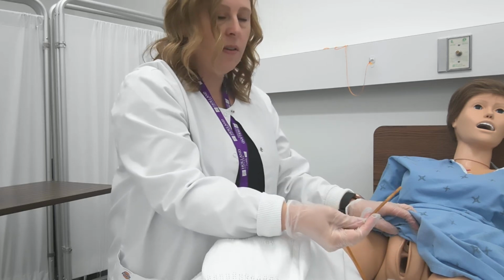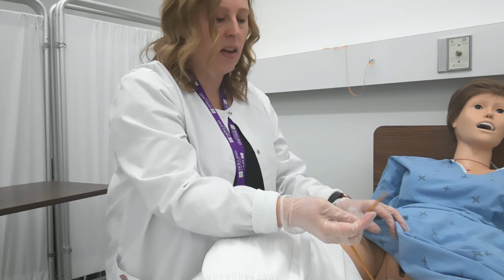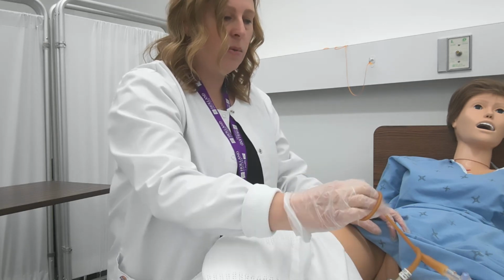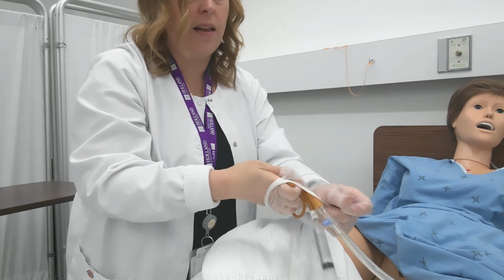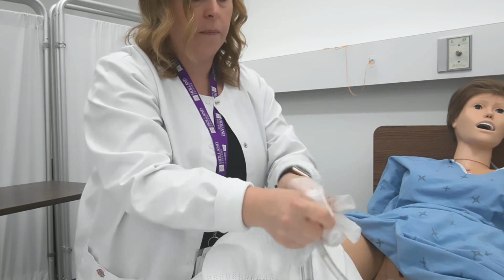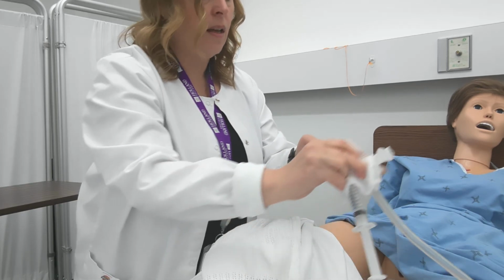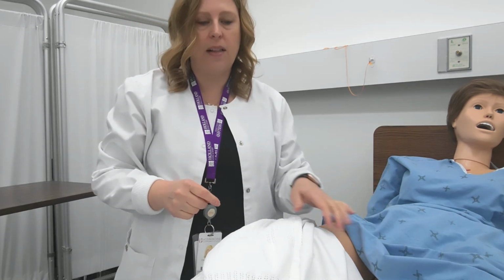I'm going to observe the catheter once I've removed it to make sure that it's all intact and that nothing got left behind. Then I'm going to roll it up into my glove, and I'm going to take my glove and put it over the end of the catheter. I'll do that with both. I'll dispose of that in the garbage later, and then I'm also going to do pericare for my client.